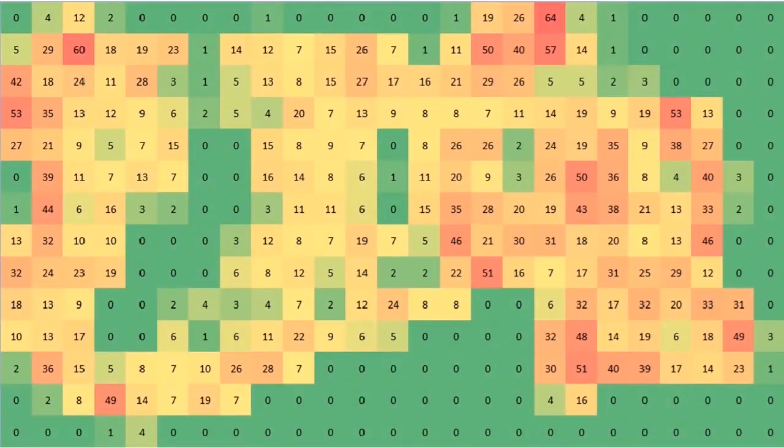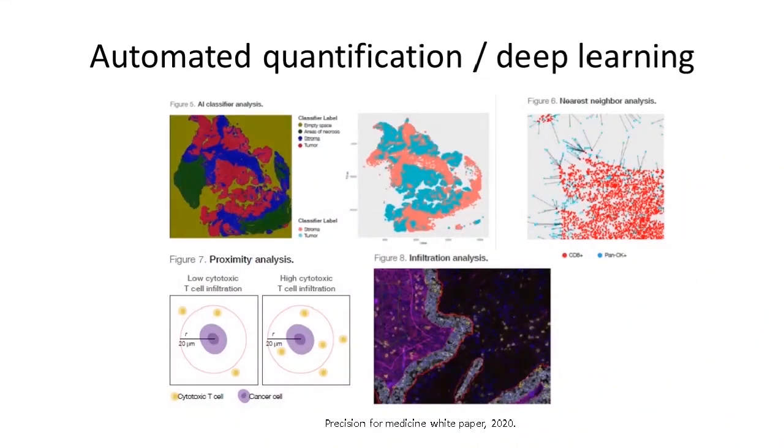And there are many approaches to this, which I will not go into at the moment, many platforms and software packages that one could use. So for instance, here we see a slide of a lung cancer where we've stained the cancer for keratin in red and for Ki67 in brown. And then doing this type of analysis, we can actually create sort of a heat map of tumor and proliferative activity, which can be used in the setting that we used it for correlation with PET-CT images. So that's a way to do the analysis.